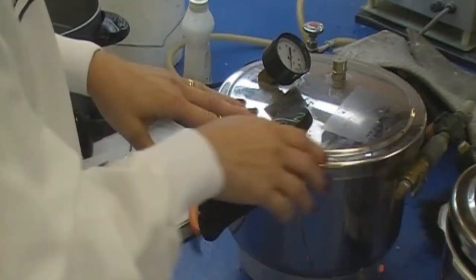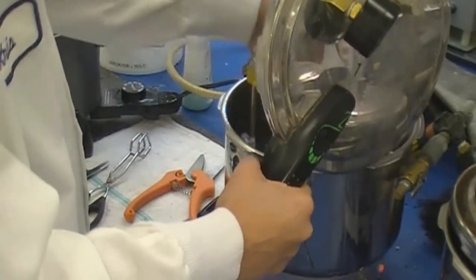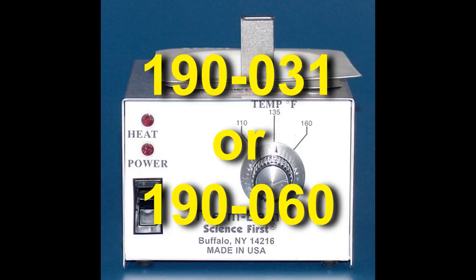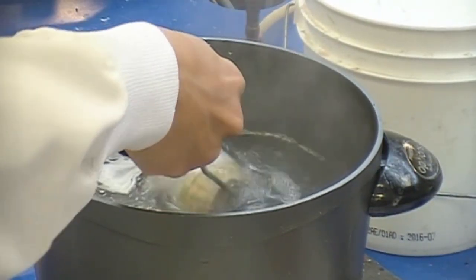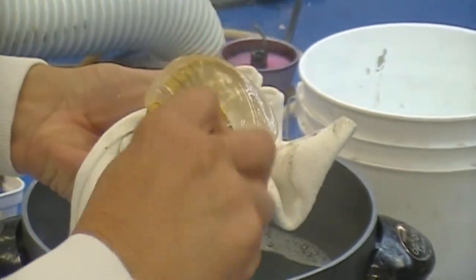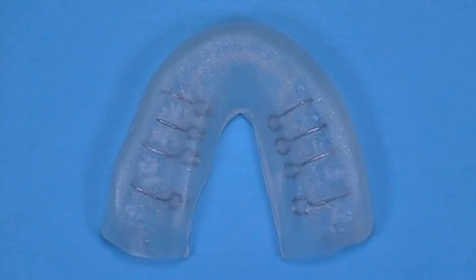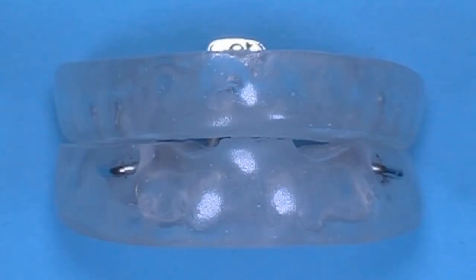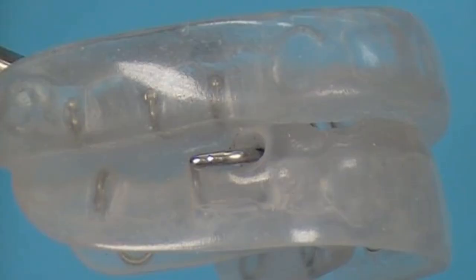Once cured, remove pressure from the pot and open the lid. Remove models and cured acrylic. A water bath or hot water pot is used to soften plastic on models at about 160 degrees Fahrenheit. Place the model with acrylic in water for about 10 to 15 seconds — this should soften the plastic to make easy removal. With a lab knife, remove acrylic from the model. To trim Variflex acrylic, standard burrs and grinding wheels on a lathe or hand piece may be used. Variflex is finished with pumice and a plastic center rag wheel, and polished with Tripoli and Fabuluster applied to 4 inch loose muslin and buff wheels.